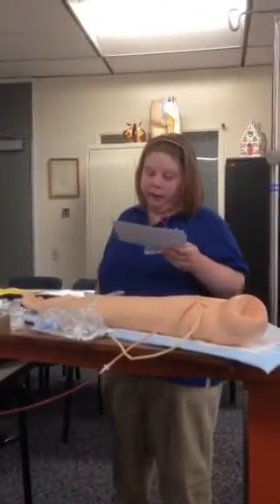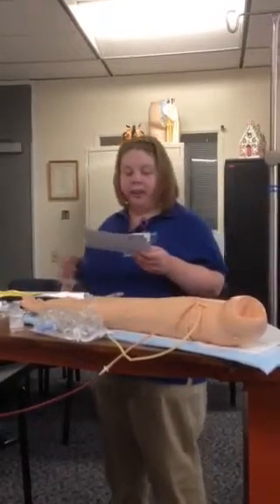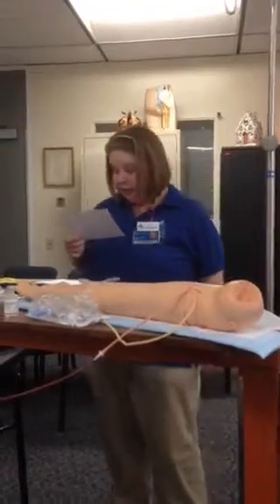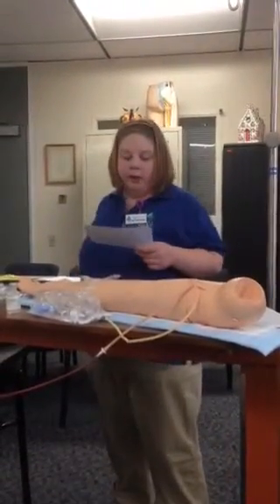Nursing implications are the whisper test for cranial nerve number 8. You would check renal function and culture and sensitivity before your first given dose, and this is my drug card. Its time to be infused is over 60 minutes. I have a 50 ml bag of saline, and tubing with a drop factor of 10, so my rate will be 8 drops per minute.